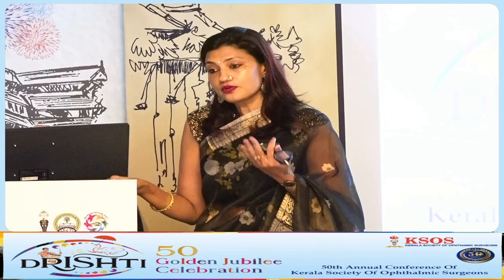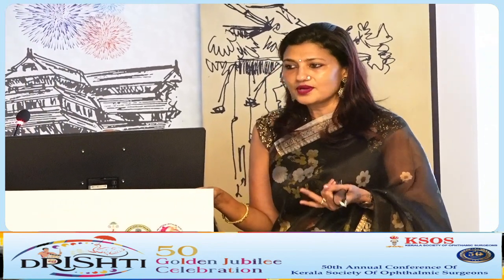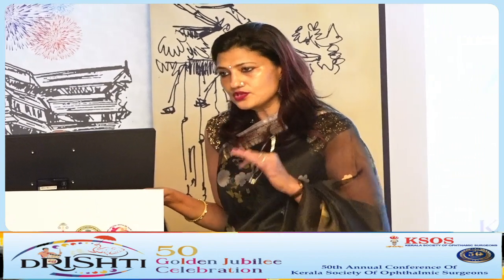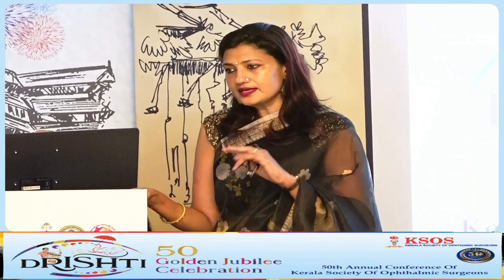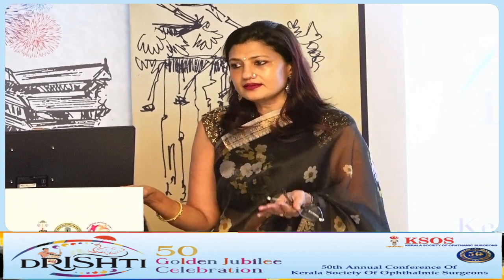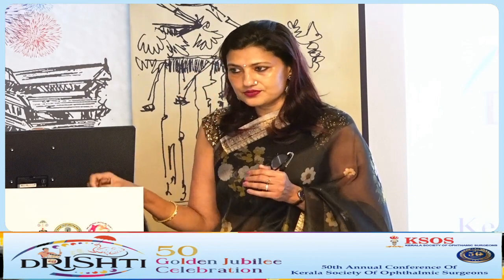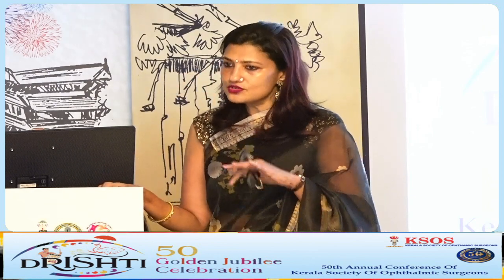It will show before visual acuity drop, but again we can't use it as a screening tool because it is not widely available. So as of now, visual acuity, visual field, color vision and pupils are the way to screen, but visual field, especially the 24-2 or the 10-2, is the way to screen.